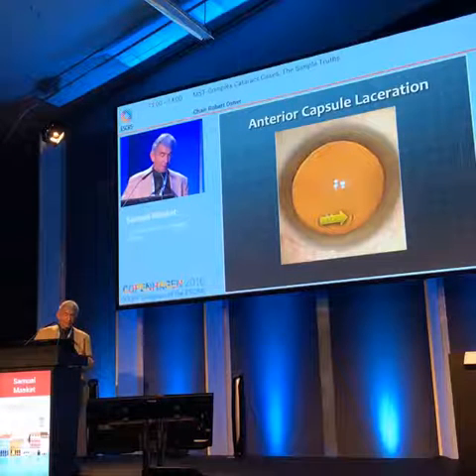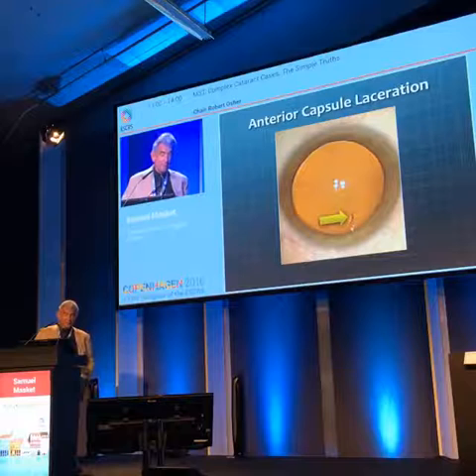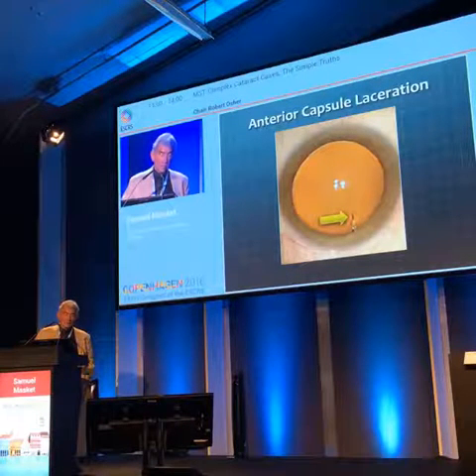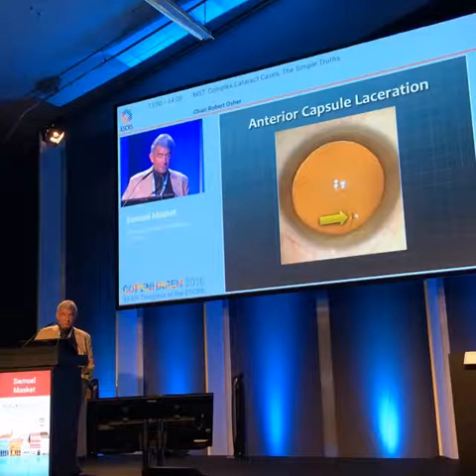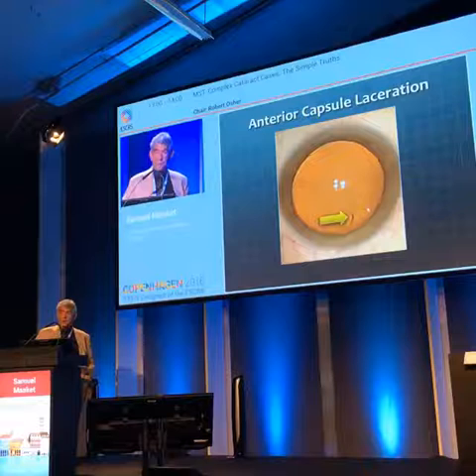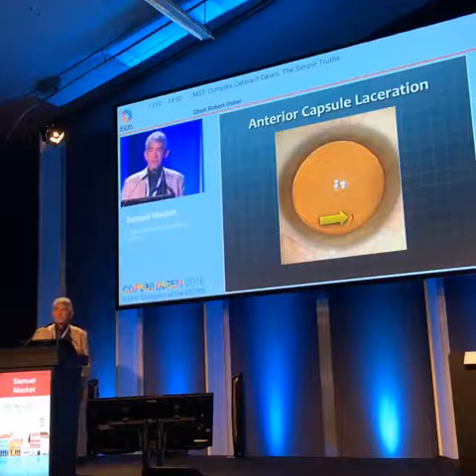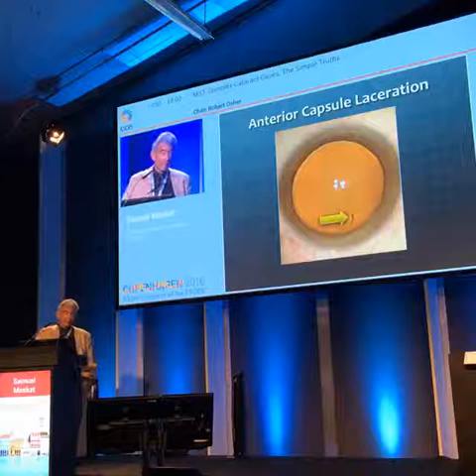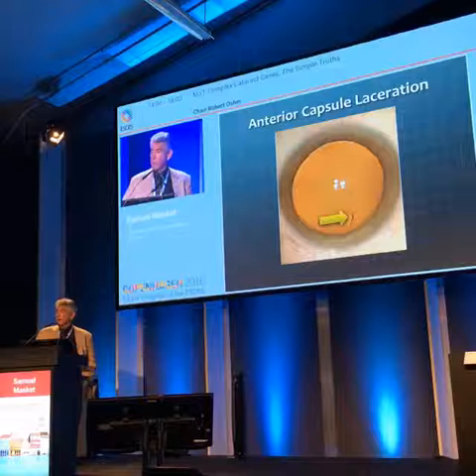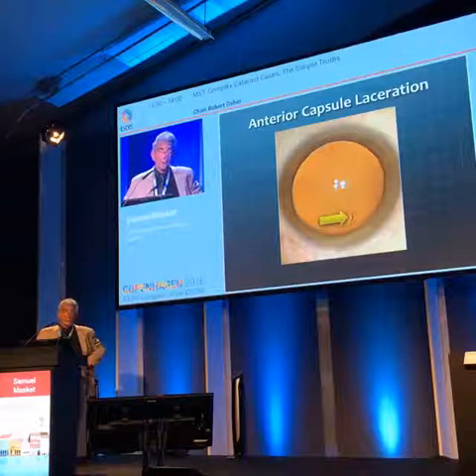And the story varies whether she looked or she didn't, but the net result was that this represents a laceration of the anterior capsule, and this is the track that the needle made going into the lens. The posterior capsule is intact, and she's sitting there with her attorney husband breathing down my neck. And to make the case a little bit more challenging, she's been a moderate myope her entire life, wearing -5.50 glasses and no contact lenses.